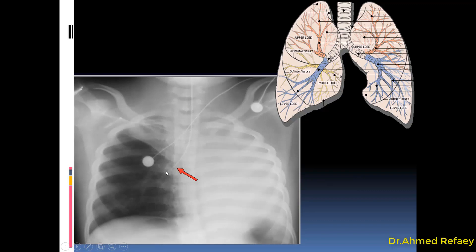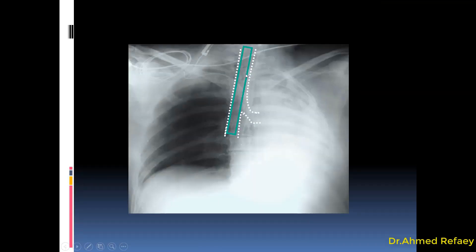Here are examples of incorrect placement. As you see, the tip of the endotracheal tube extends to the region of the right main bronchus, obliterating the right upper bronchus, causing complete collapse of the right upper lobe, and obliterating the main left bronchus with resultant complete collapse and opacification of the left hemithorax. In another example, the tip goes into the right main bronchus causing complete collapse of the left lung with shifting of all mediastinal structures to the left hemithorax, which is seen completely opacified.